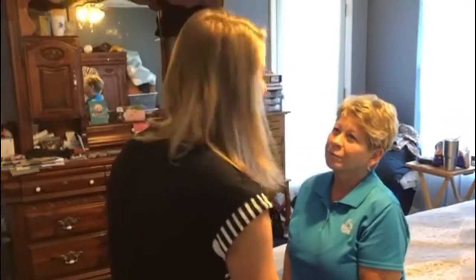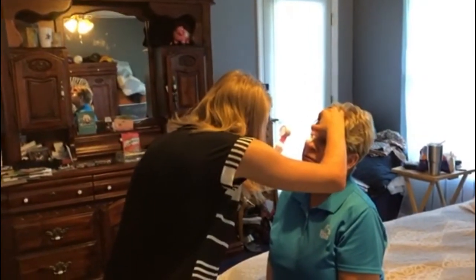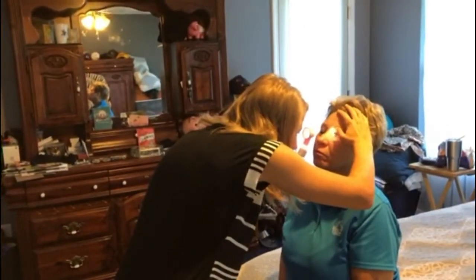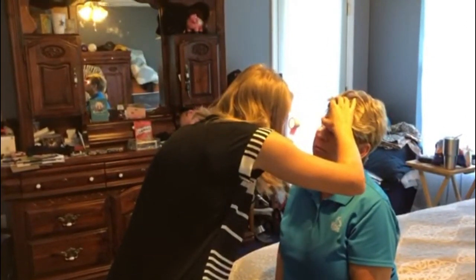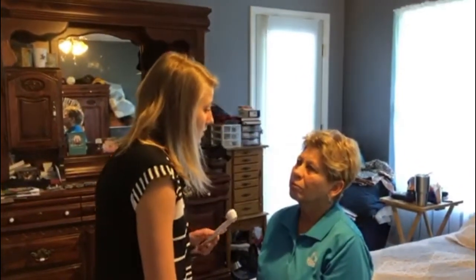I'm now going to take my ophthalmoscope and go ahead and do an exam of your eyes. Just go ahead and stay very relaxed. Her lens is clear in this eye. I see her retina is orange. Also clear in this eye, and her retina is orange. I note the red reflex in both eyes. I can also see her blood vessels are within normal limits. There is no bulging. There doesn't appear to be any damage or extra redness or anything like that.